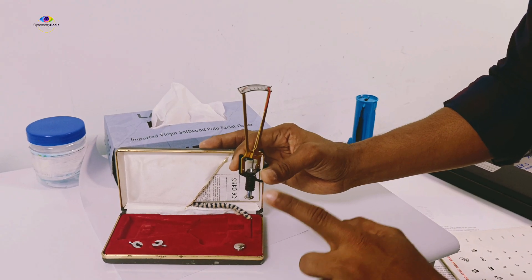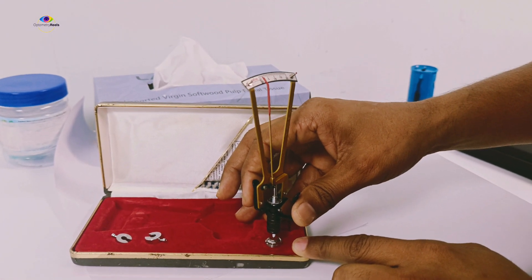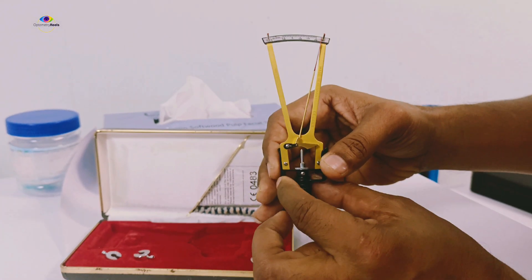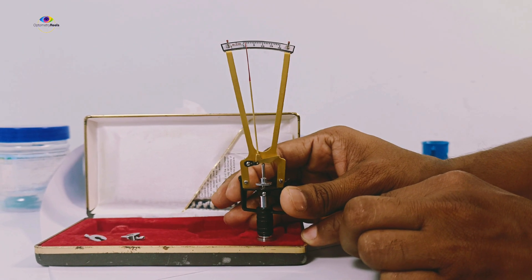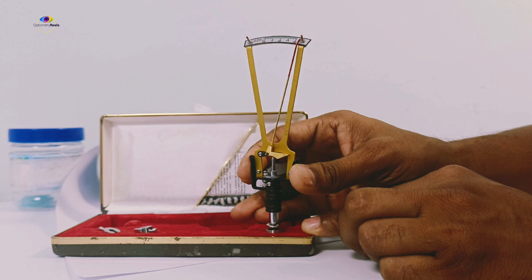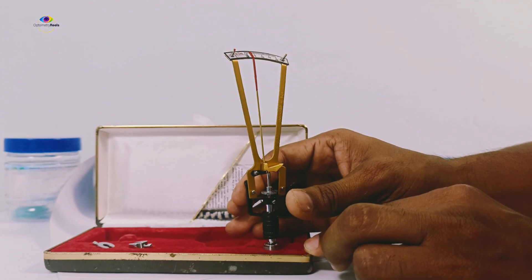Before applying on the patient, you must check on this test block. Place the instrument on the test block and the needle should be at zero — zero means the instrument is calibrated. You have to ensure that the plunger is hanging freely in the center and that you are not applying extra pressure. Just place it so it rests freely, and the needle value should be zero.